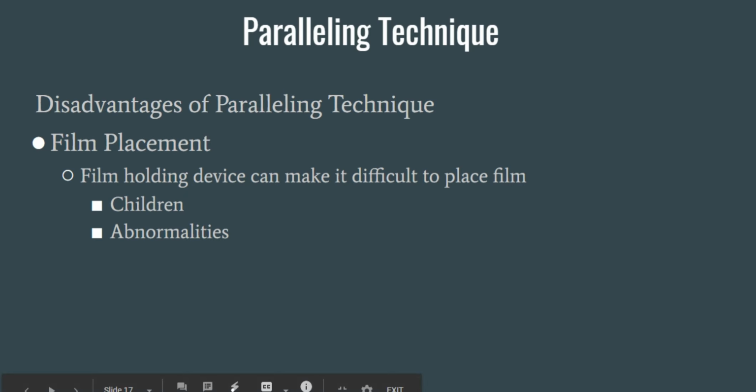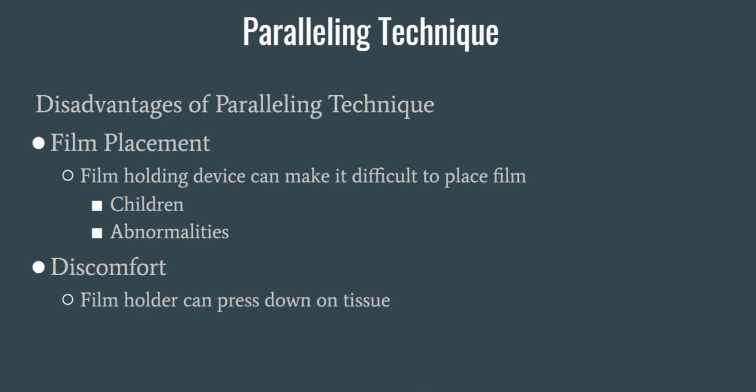So the second disadvantage is going to be that discomfort. The film holder can press down on the tissues, it's going to pinch, it's going to make their tissue a little bit sore potentially, but we have ways around that. We have things we can use. And with the Styrofoam sticky tabs that act like a cushion, that is almost eliminated.